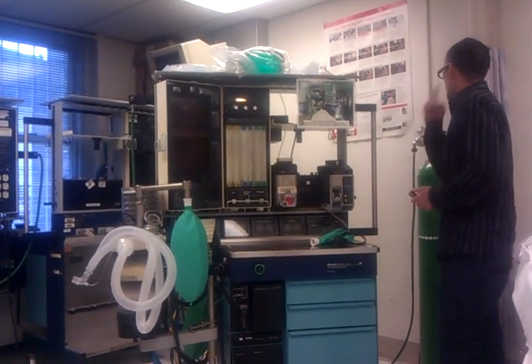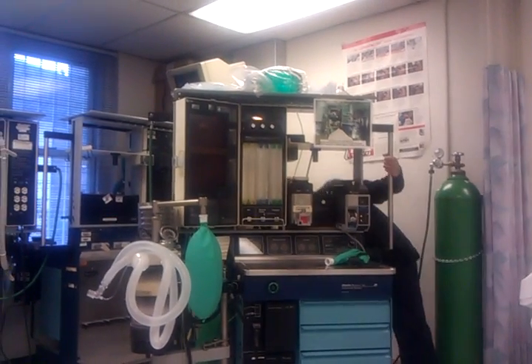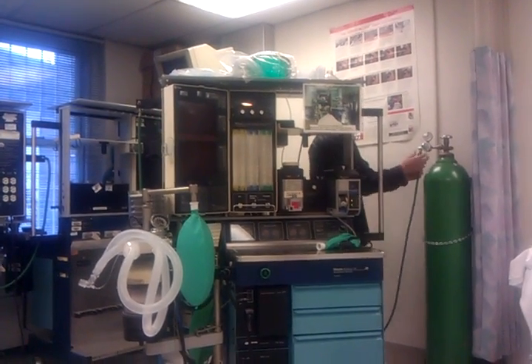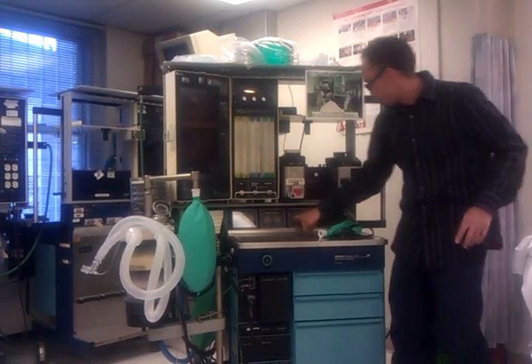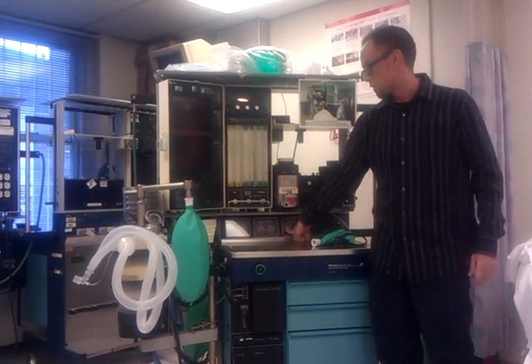Now I'm going to check my main line air supply and check that my hoses are connected. Yellow is for air, blue is for nitrous, green is for oxygen. I'm going to make sure it's connected to the wall slash tank. My PSI is 50 on my pipeline gauge, so I'm good.